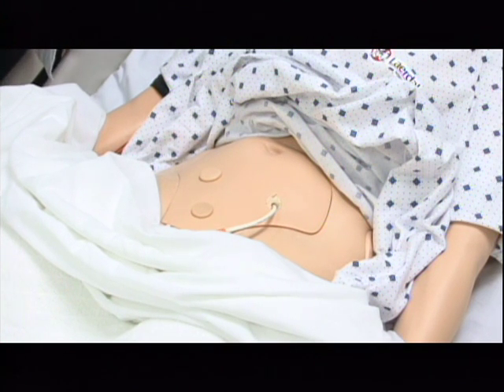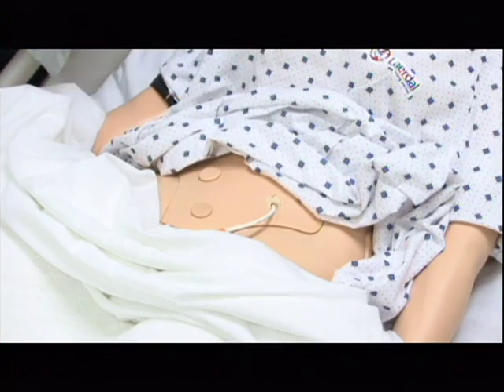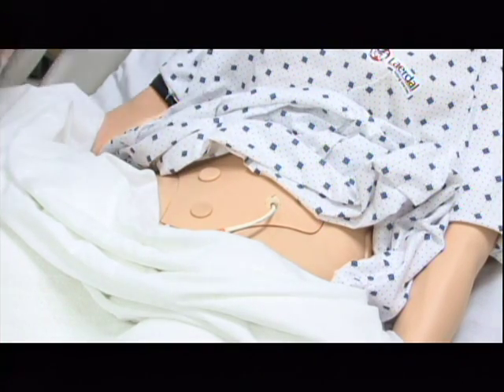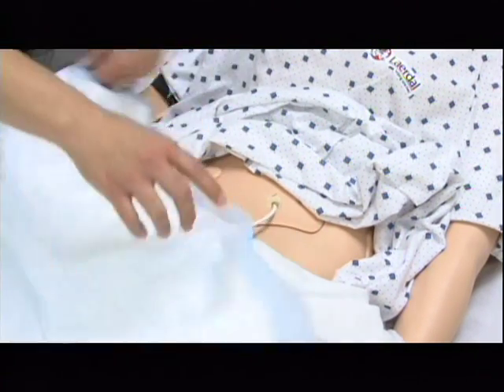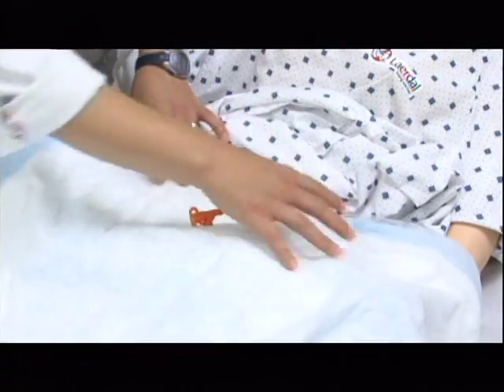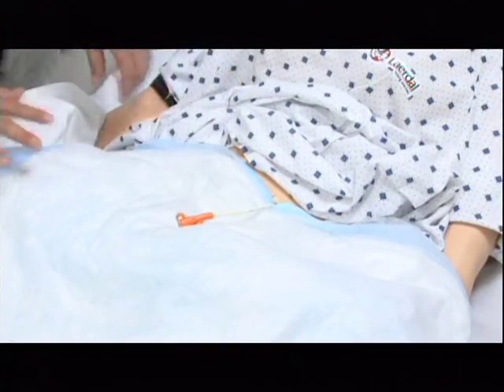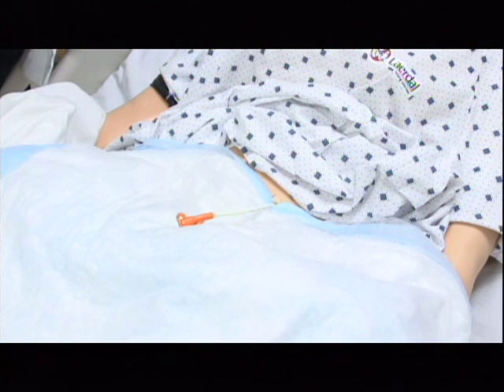The next thing I'm going to do is move on to check gastric residuals. In doing that, I'm going to prepare my equipment. For her, I'm going to take a waterproof pad and put this down underneath the tube, because this can get messy, and to avoid getting her bedding dirty or getting her dirty. I've got that down. And then certainly I need to have established with her how she needs to communicate with me if I need to stop during the tube feedings, if she starts having discomfort or feels sick to her stomach.